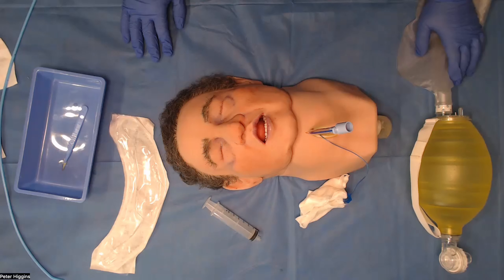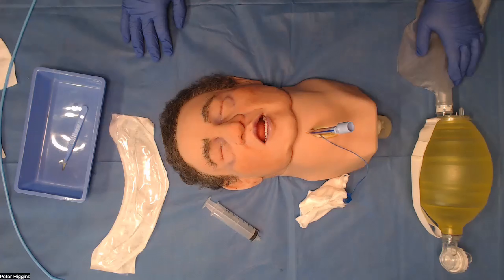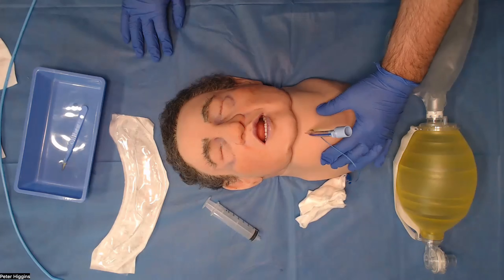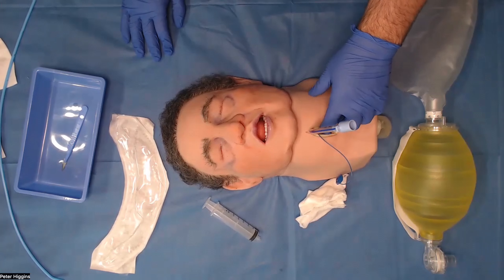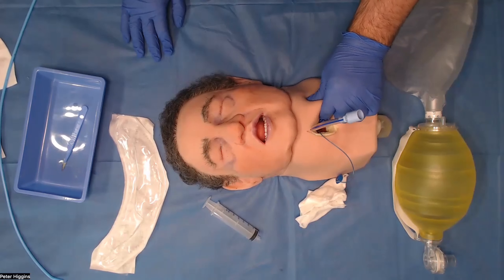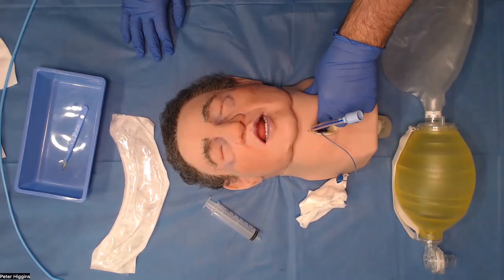And that's front of neck access performed. This model is very realistic in the sense that it is incredibly difficult due to the amount of adipose tissue actually surrounding the neck. The anatomy looks cracking, looks really good.